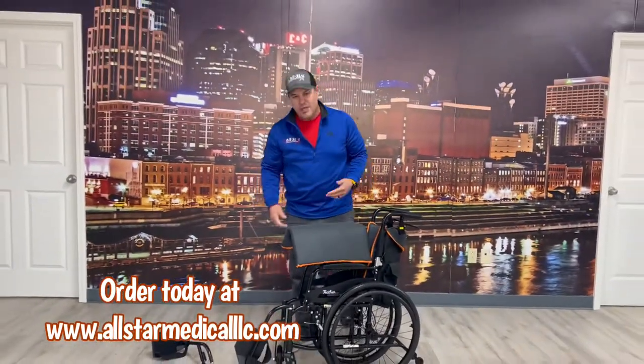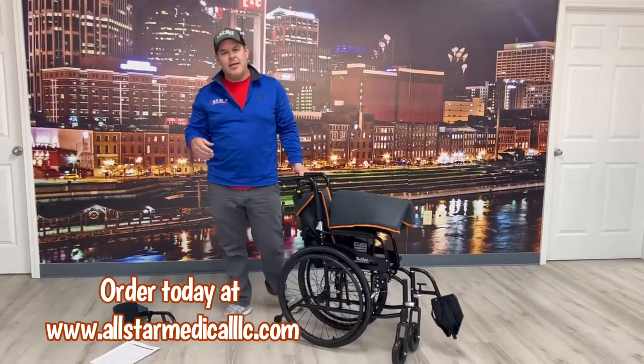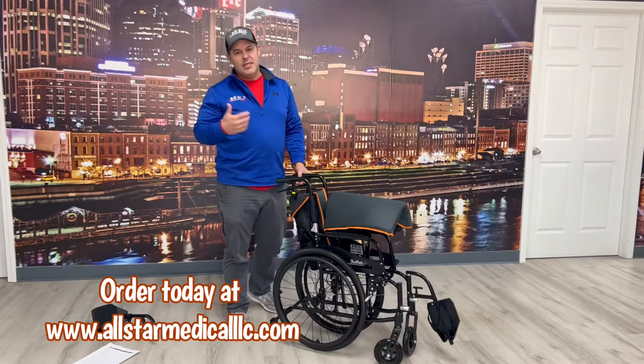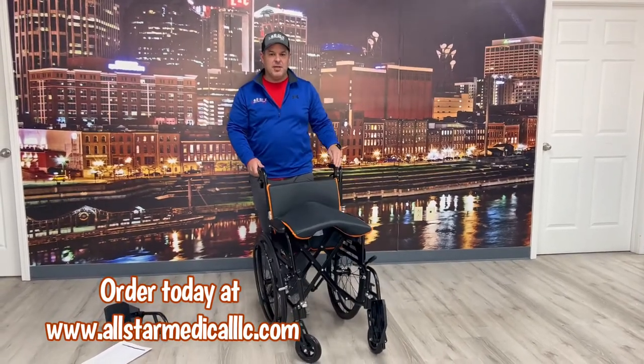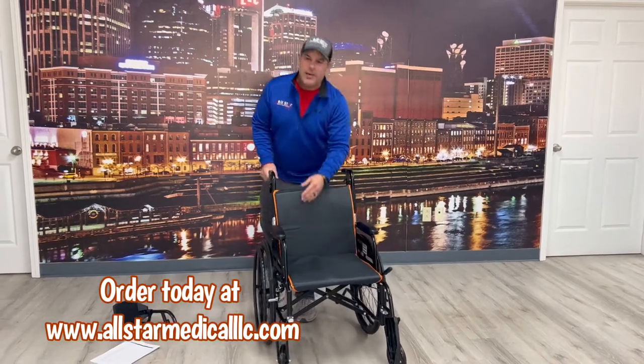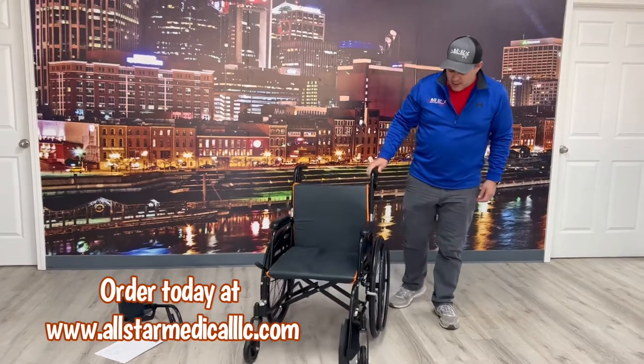When folding the chair up, we recommend just grabbing on the inside and folding up. Getting down to as low as thirteen and a half pounds — you won't find a manual wheelchair that gets that light unless it's some specialty chair that costs a lot of money, and that's not the case here.